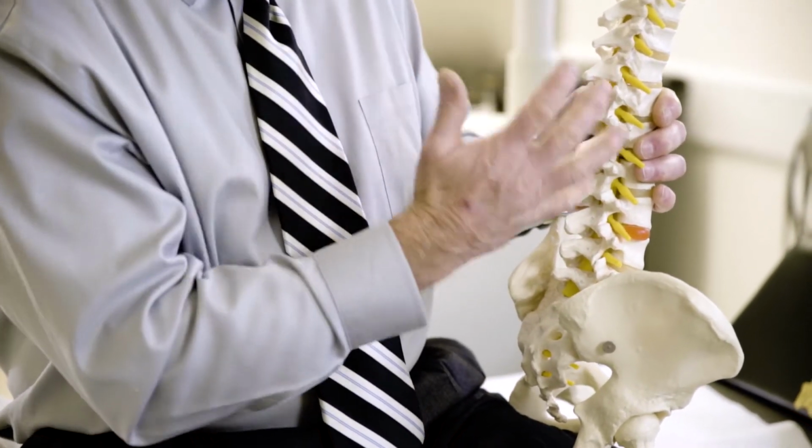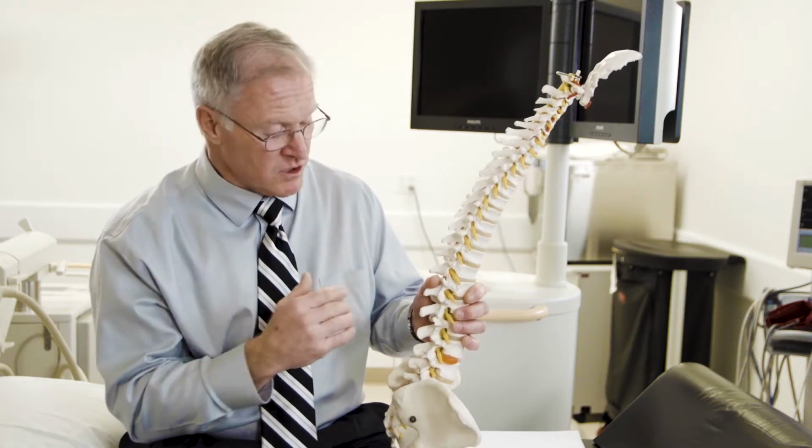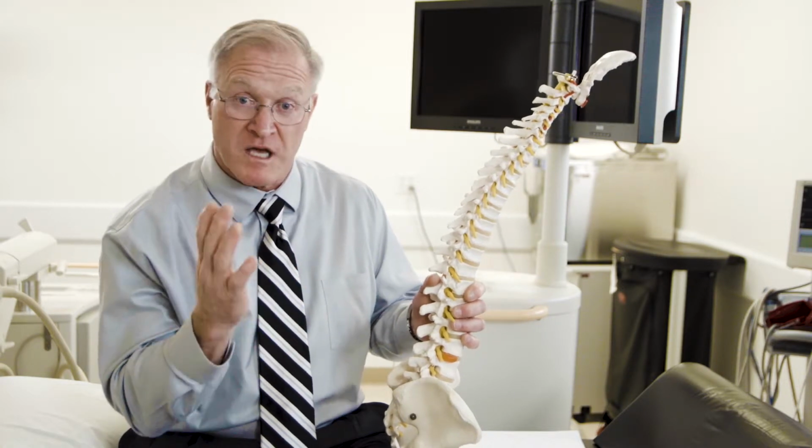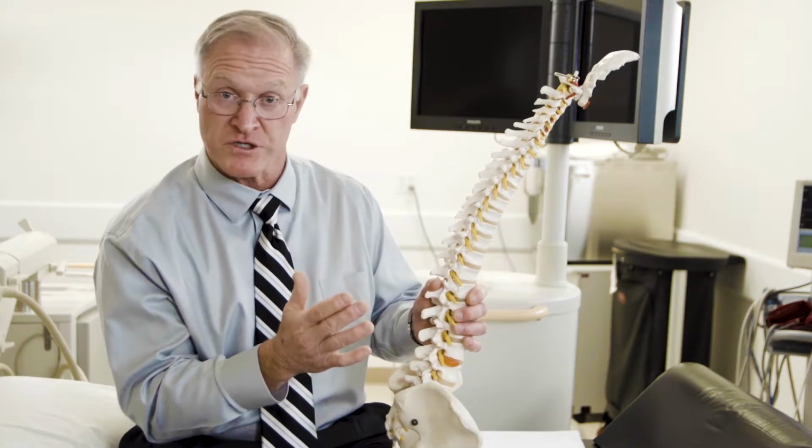Now, during that procedure, I'll be watching the procedure on fluoroscopy, but nerve roots don't show up on x-ray, but we know that they're there, and so we go very slowly at that point in time. You'll have light sedation, but you'll be able to communicate with me because I'll be asking you to specifically tell me when you start to feel any type of discomfort or pressure in your leg.